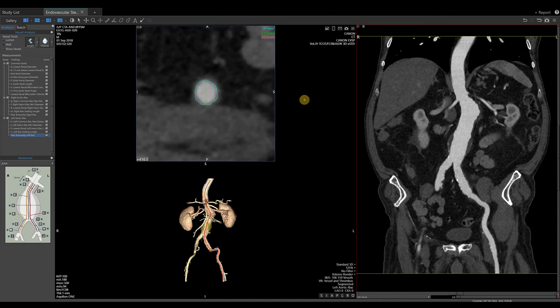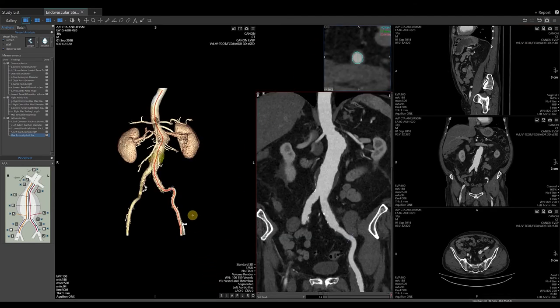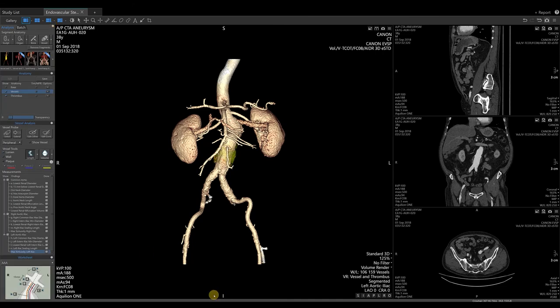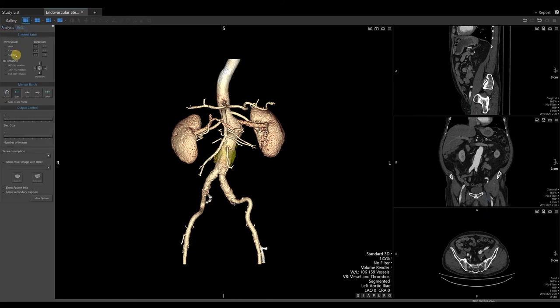To return to our original 3D layout, either double left-click in the 3D viewport or select the one-down button in the upper right corner of the 3D image viewport. To remove our vessel probe lines from our image, in the upper left-hand corner, uncheck Show Vessel. This provides just the single 3D image while hiding the curved planar reformat. Expand your anatomy section by selecting the chevron in the upper left. To create a 3D batch of this image, in the upper left-hand corner, select the Batch tab. In our Scripted Batch section, under 3D Rotation, select the desired rotation — typically a full 360 as standard.